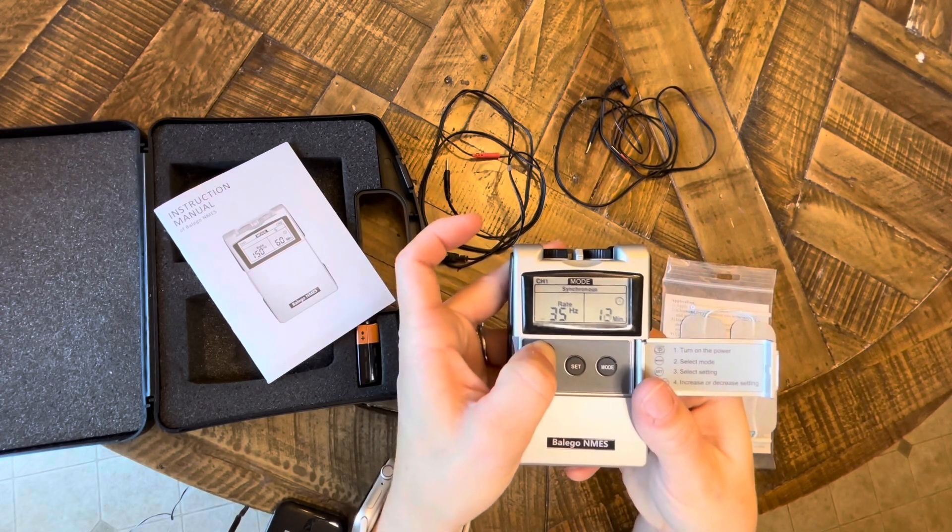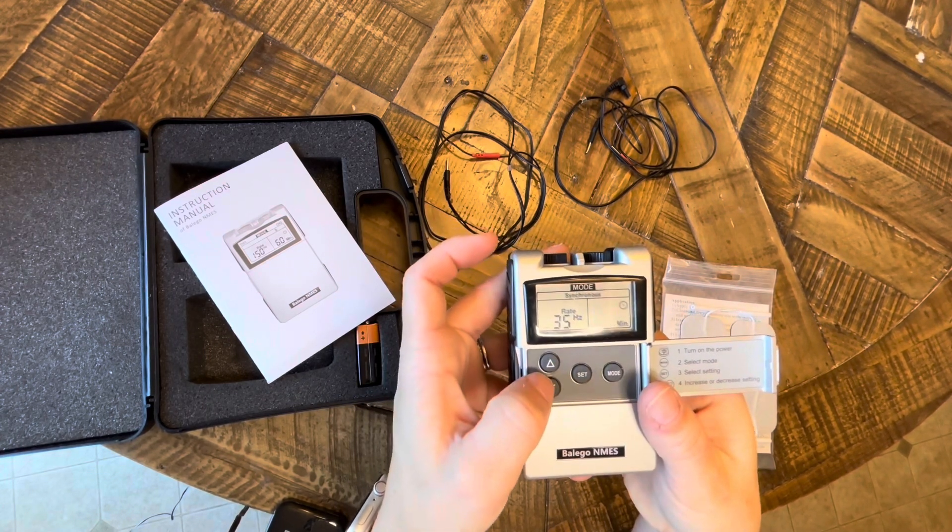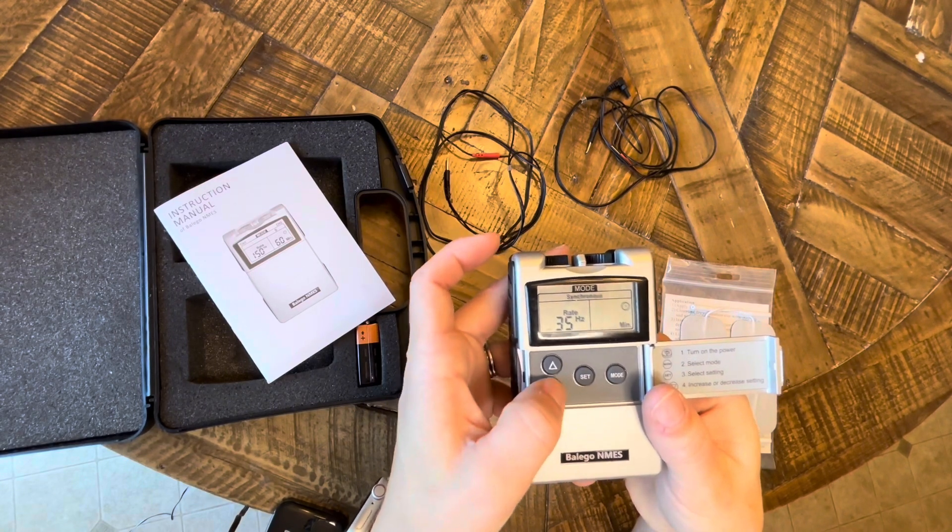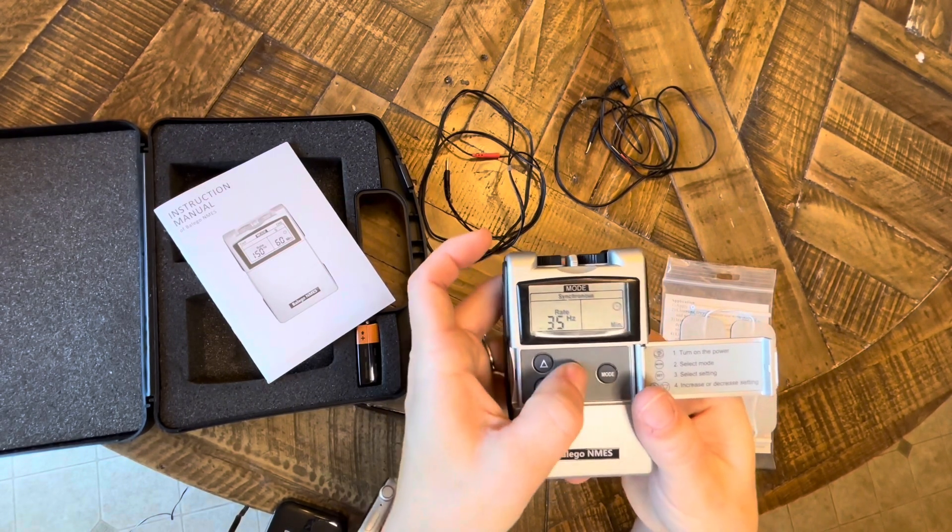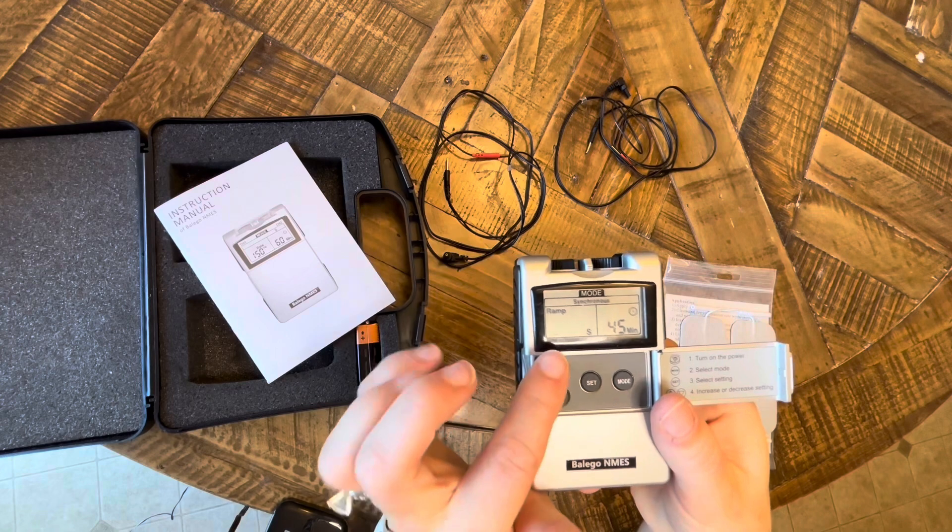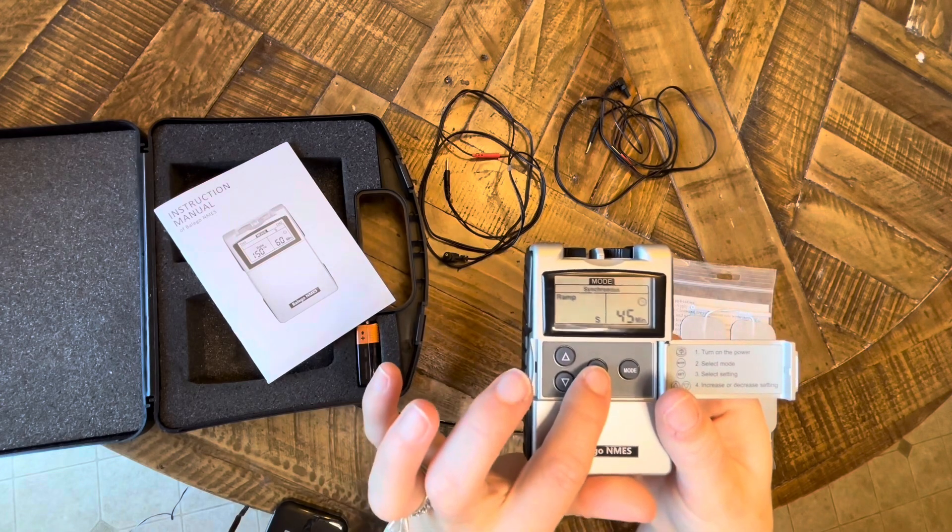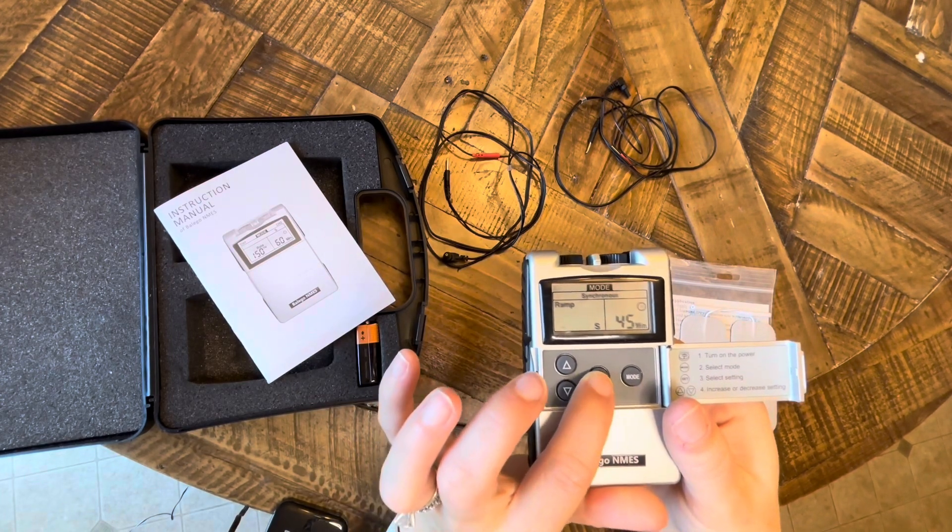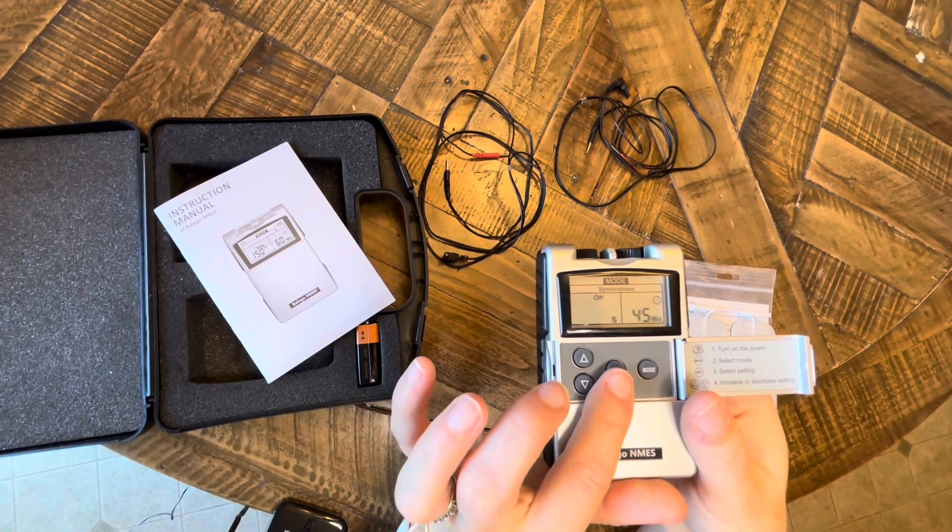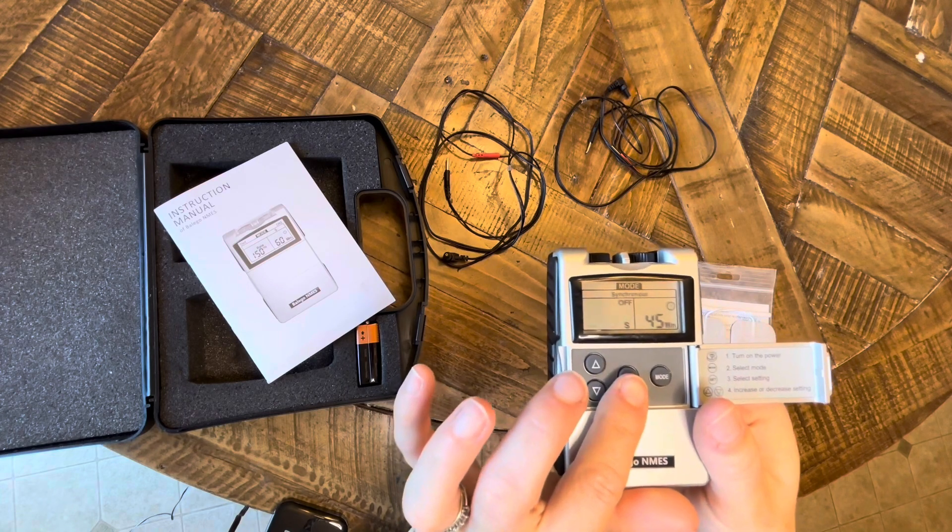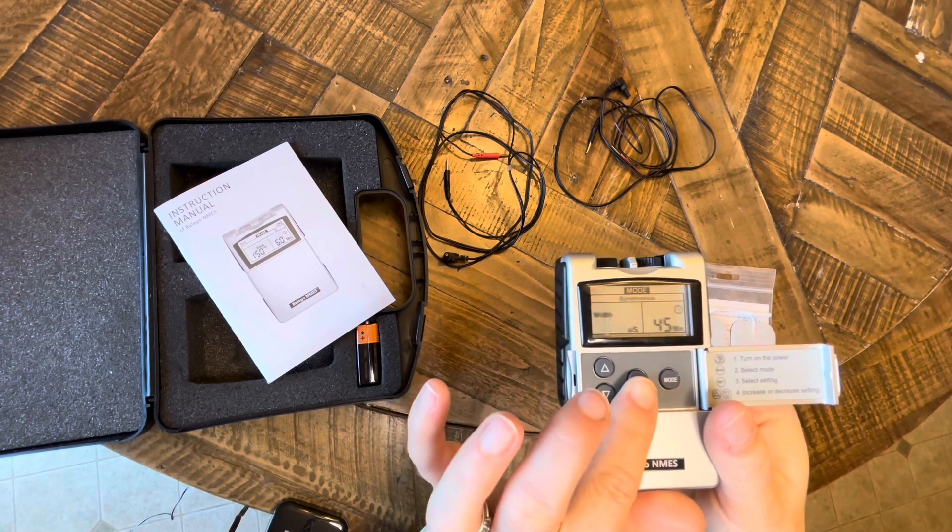That way I can maximize the amount of repetitions that I'm getting in, because that's the whole purpose—you want to get in many, many reps to promote neuroplasticity for motor recovery. So I'm going through here and I'm changing those all to five seconds on, five seconds off, one second ramp.